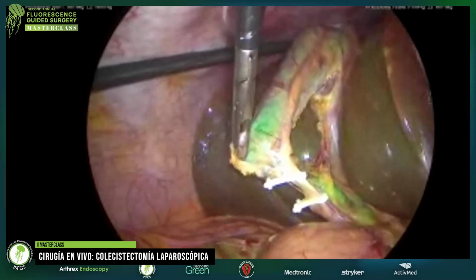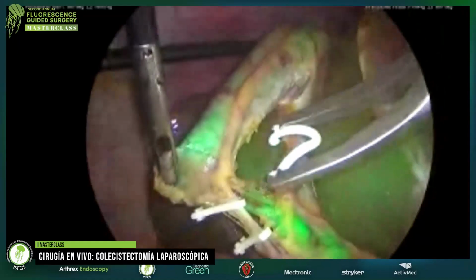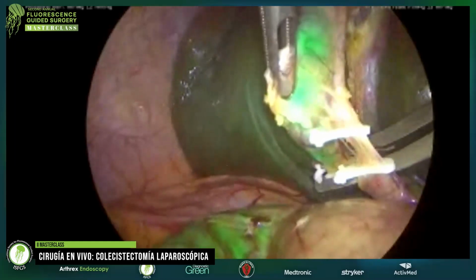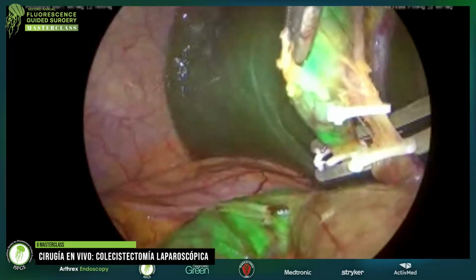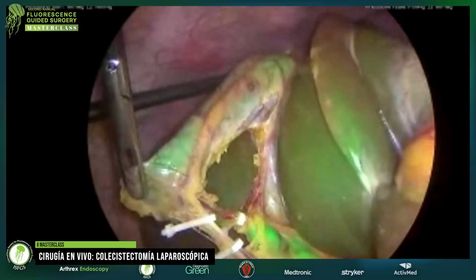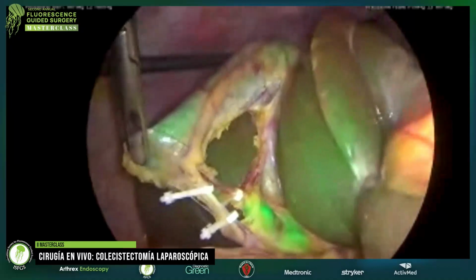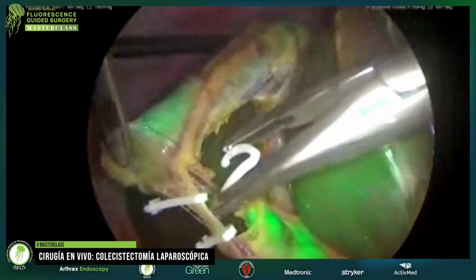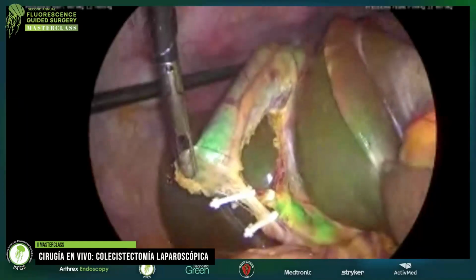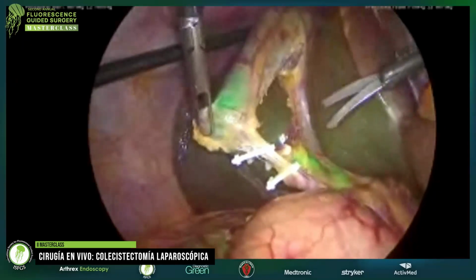Okay. Well, it really depends. I think it's very well spread. The adoption is not 100% for sure. I think that in the hospitals that have the technology, there is a good adoption of it, but it's still not 100%. I don't know how much it is spread in your country, but I think it is increasing very well, because today all the laparoscopic systems on the market have the technology inside, and even some of the robotic systems have the technology, so it's spreading very well.